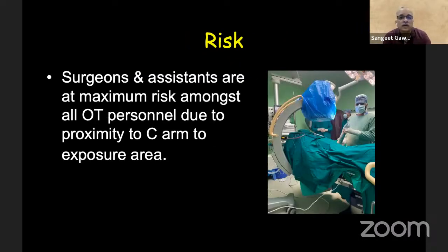Now, who is at risk whenever you are doing this? It is the surgeon and the assistant who are at maximum risk amongst all the OT personnel, because we are closer to the C-arm and the exposure area during the shots which we are taking.